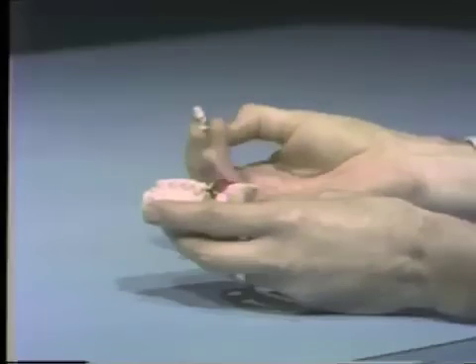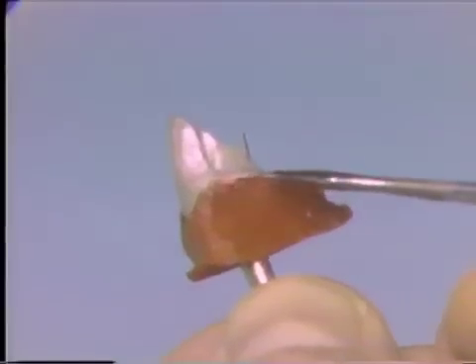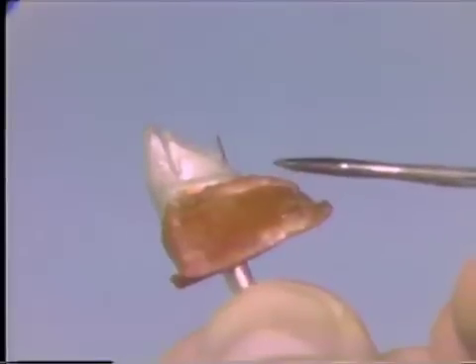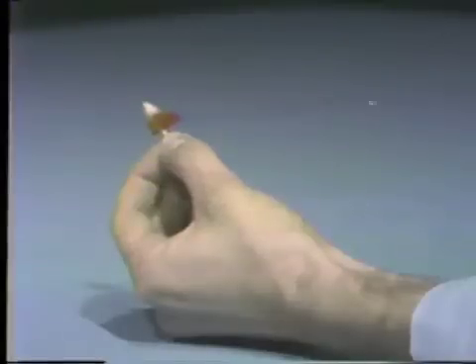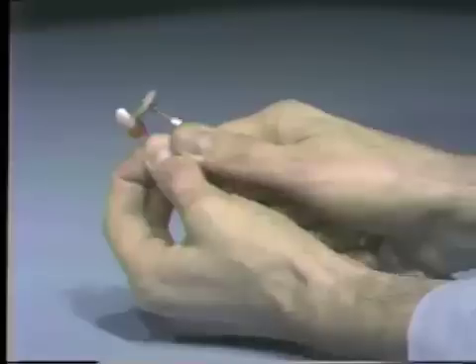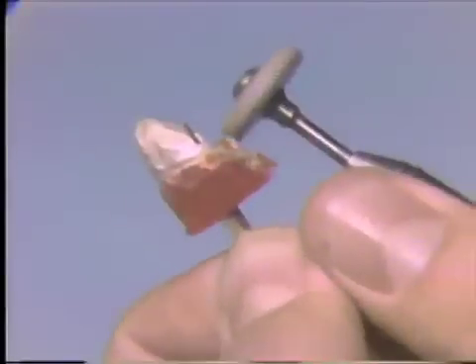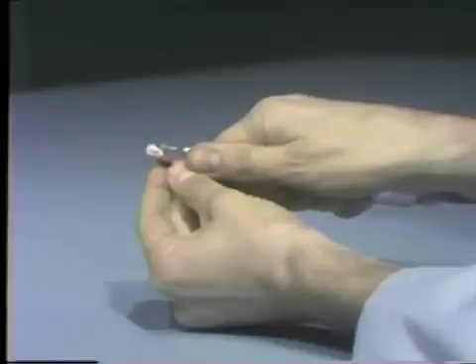The dies are then carefully placed back in the model. The dies are now ready to be trimmed. The objective of trimming is to clearly expose the margins of the dies so that waxing and finishing procedures can be carried out easily. The gross removal of Duroloct is first done with a heatless stone, taking care not to damage the margin. The final trimming is done with a small green stone.